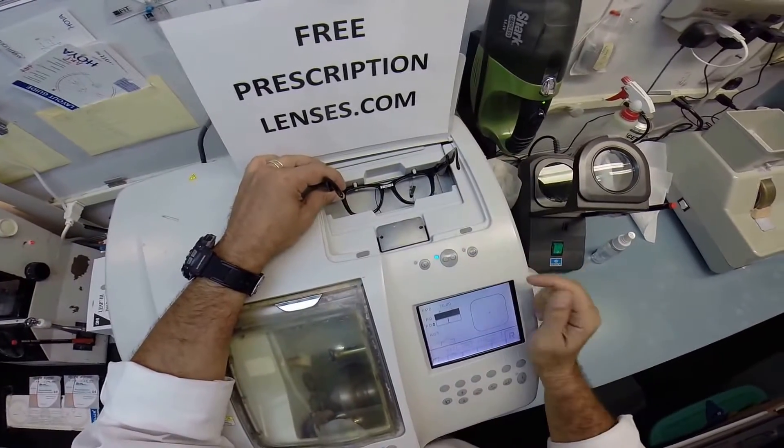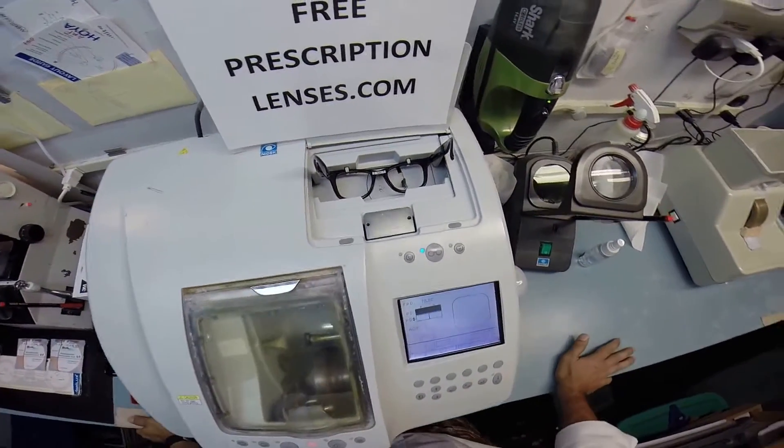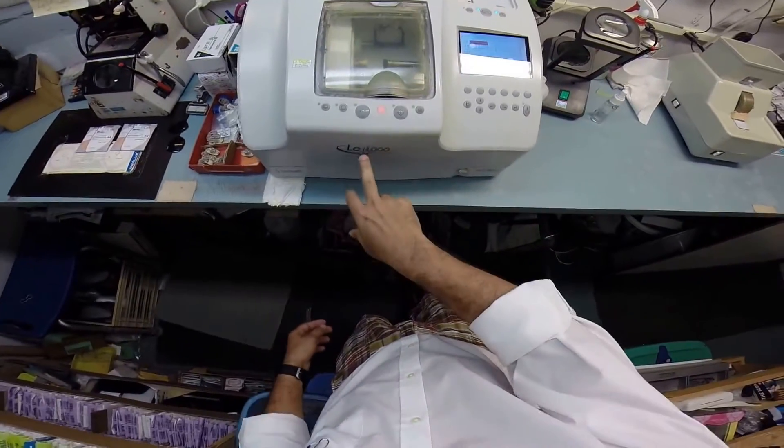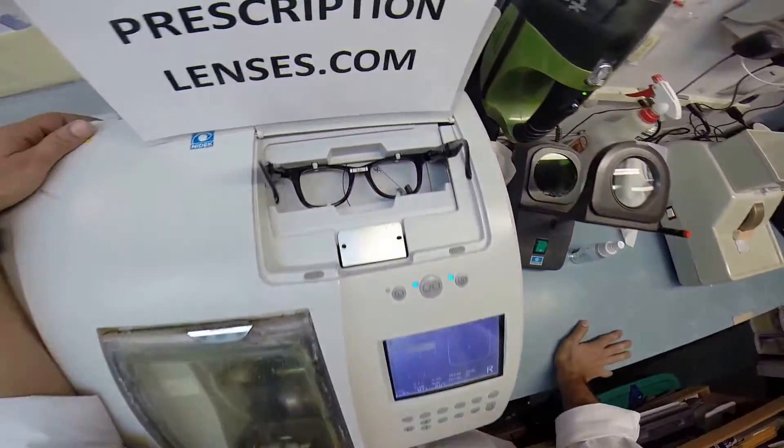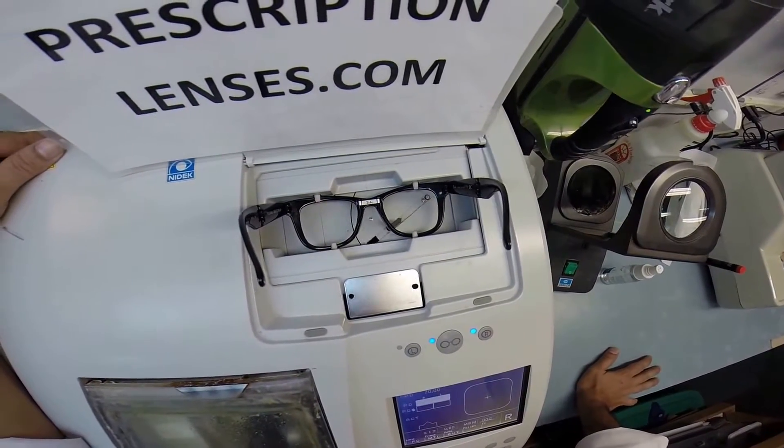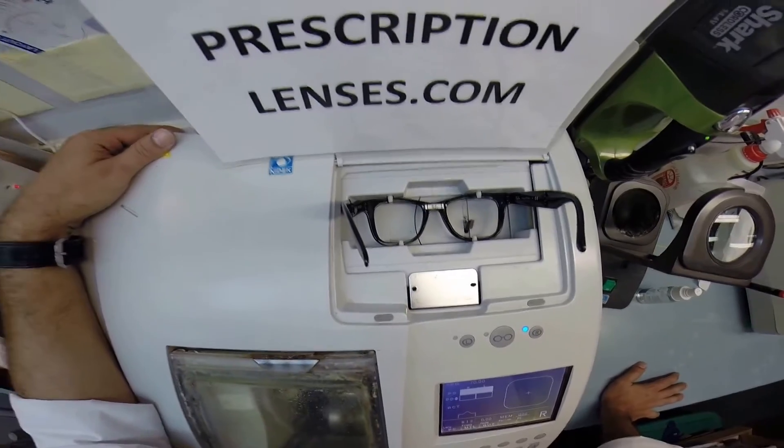The first thing I need to do is trace the shape of his frame. I'm using my Santinelli - this is my thirty thousand dollar LE 1000 patternless edger. The stylus is tracing the shape of the right lens, then it's gonna move over and trace the shape of the left.